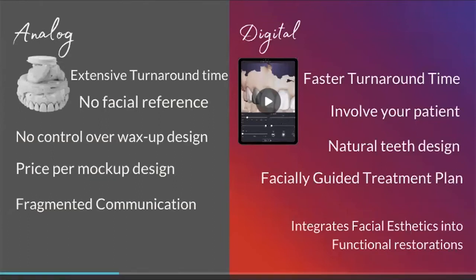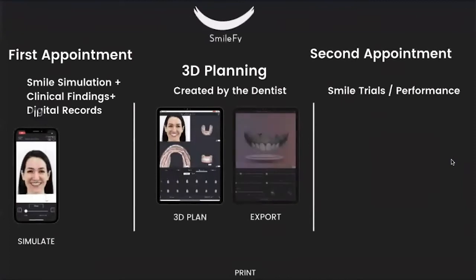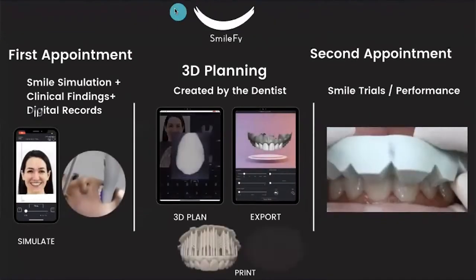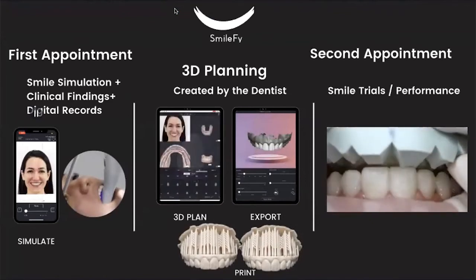Okay, great. The reason why I'm asking is because I want to guide this webinar and use this time that you are investing here today, so you can leave this webinar knowing how to create a workflow in your practice. By the way, the workflow that I'm going to show you today focuses on the patient, okay?